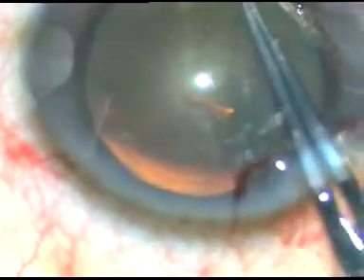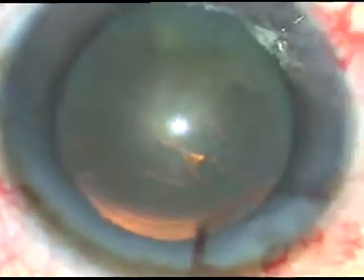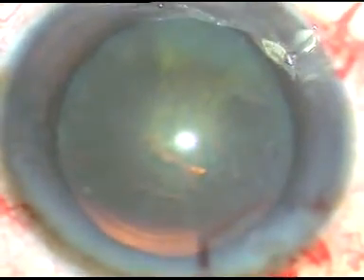This is a large rhexis, about 6 mm, and now I am going to do hydrodissection. BSS has been taken in a 2 cc syringe, and a 27-gauge cannula is attached to the syringe.